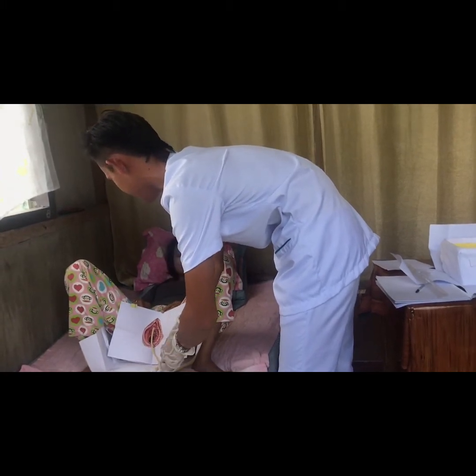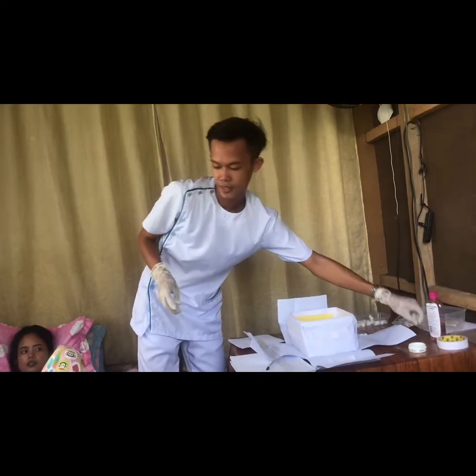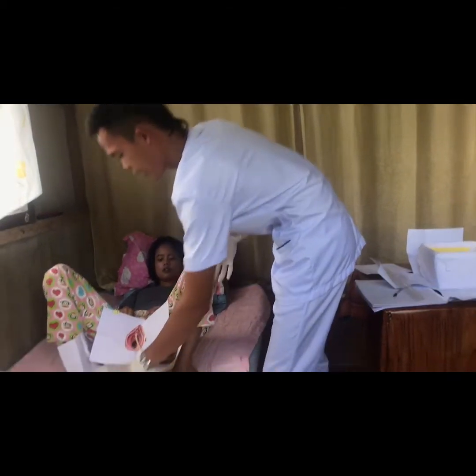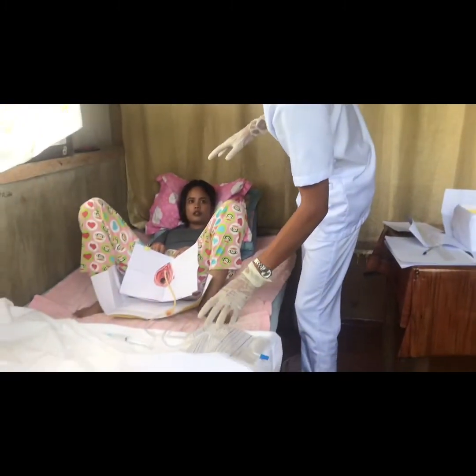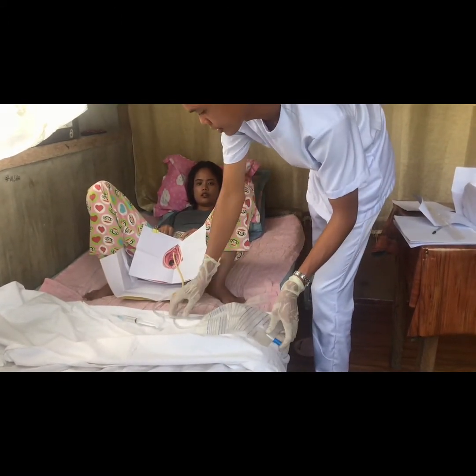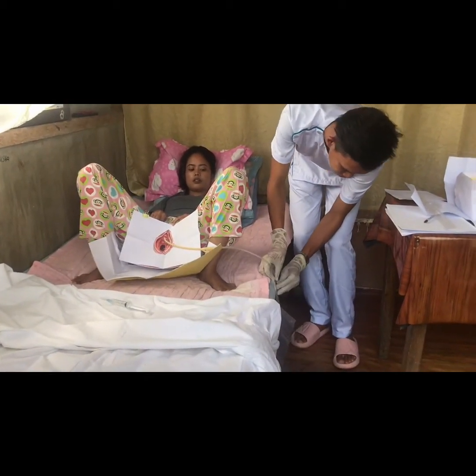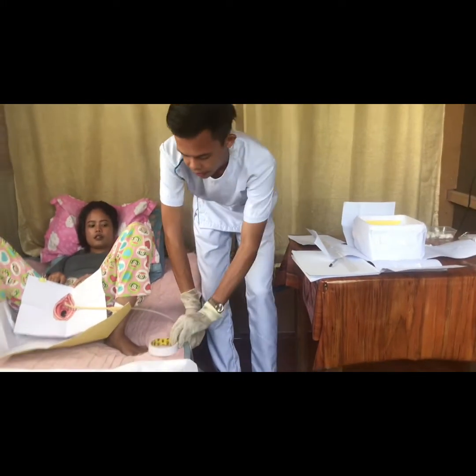Okay, thank you. So after inserting the 10 cc syringe, we're going to set it aside. And then for this time, I am going to have my urine bag. I'm going to place it on the side railings of the patient, okay? Here, in this portion. Are you okay, ma'am? Yes. Okay.